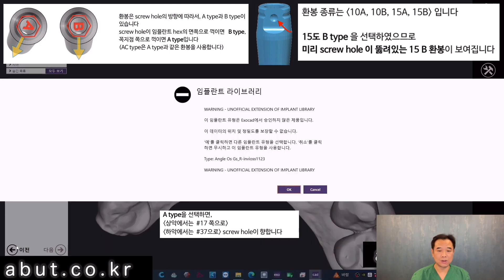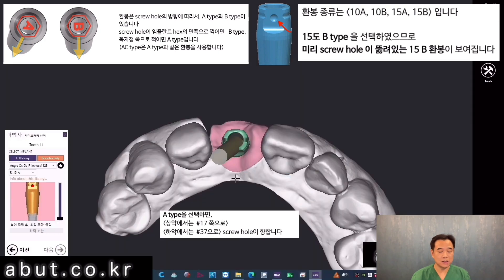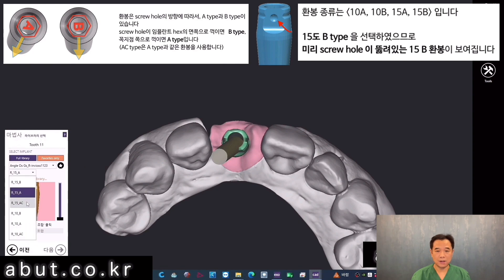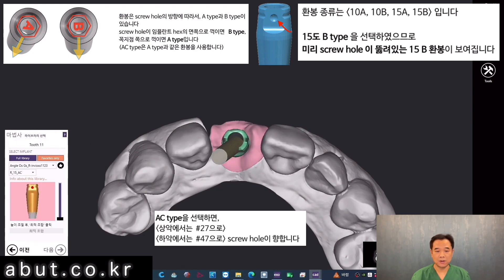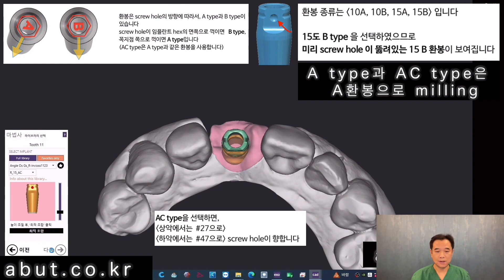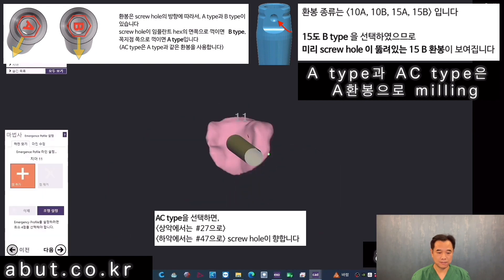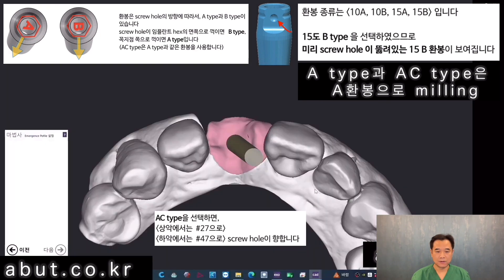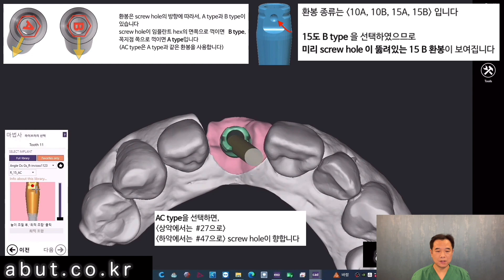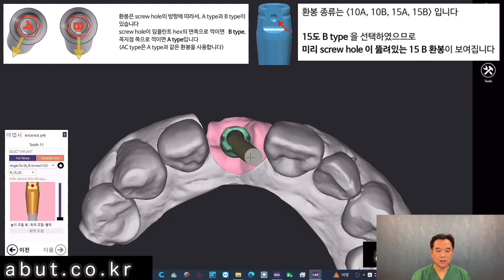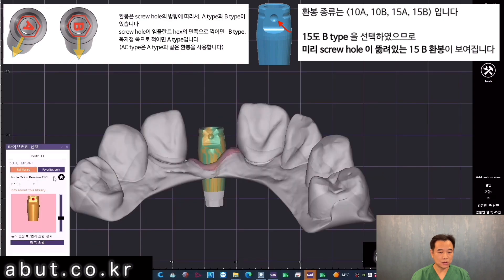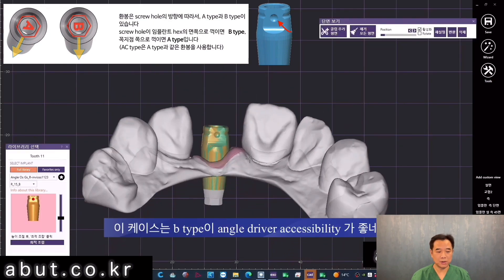For instance, sometimes 15-AC is chosen. The AC type has a screw hole facing the 2-7 in the maxilla and 4-7 in the mandible. Both Type A and Type AC have their hole facing towards a point, so the A-type blank is used for milling in both cases. In this particular case, I will select the B type since it has better angle driver accessibility from the lingual side.